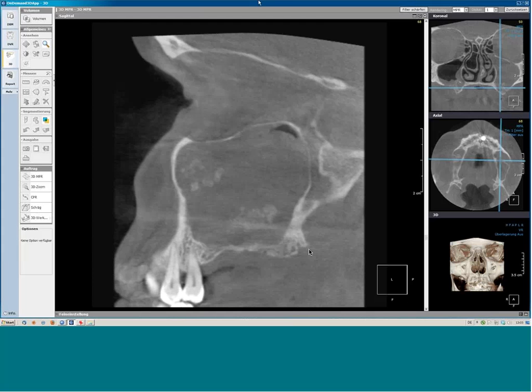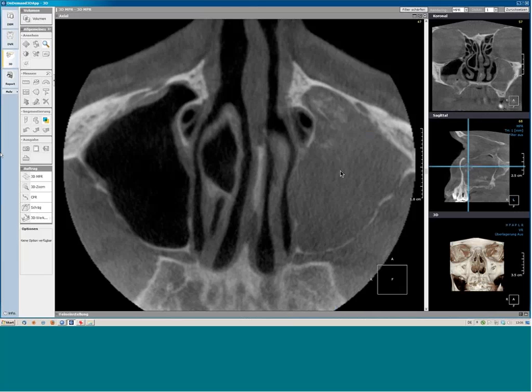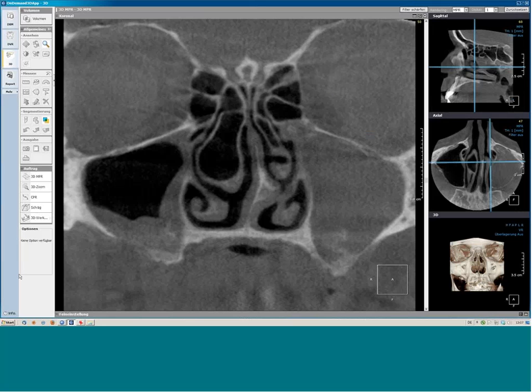So due to this acute sinusitis, the whole augmentation material was lost, and even some portions are here in the front, and another portion of the augmentation material is here near the physiological ostium of the maxillary sinus, so that even the normal drainage way of the maxillary sinus was blocked or obstructed, so that the process got more and more severe, and finally the whole implant planning was thrown away.